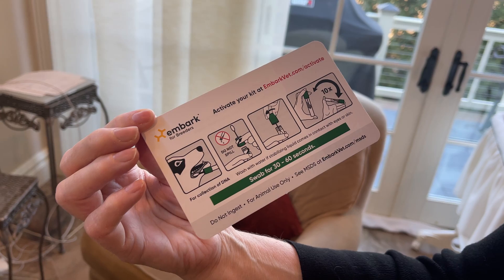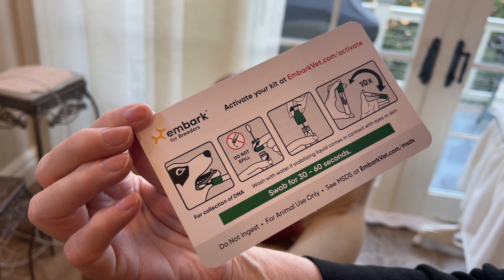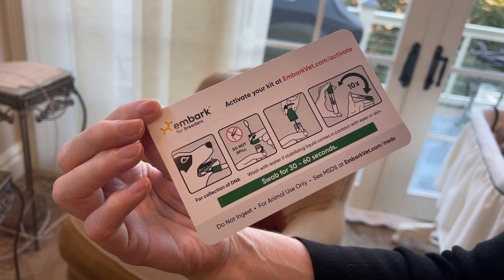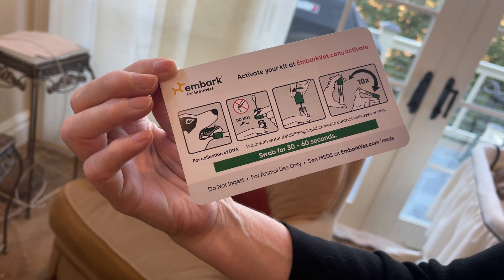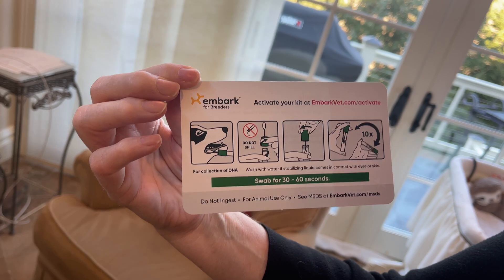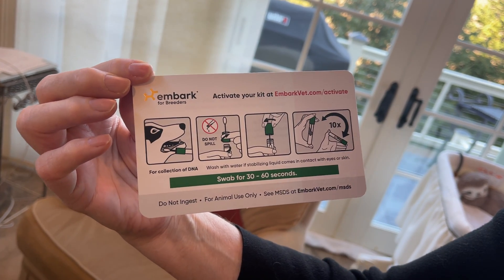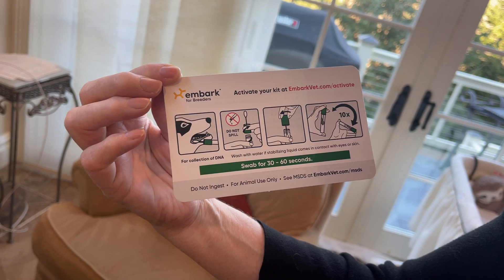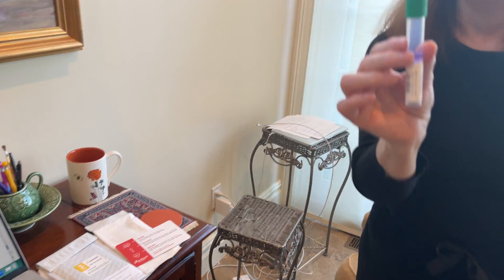EmbarkVet.com is the place you can get this. Here's how you do the test: activate your kit at EmbarkVet.com/activate. I already did this in my breeder profile. First, we collect the DNA by using a swab in the mouth, and we swab for 30 to 60 seconds. Now let me show you what that looks like.